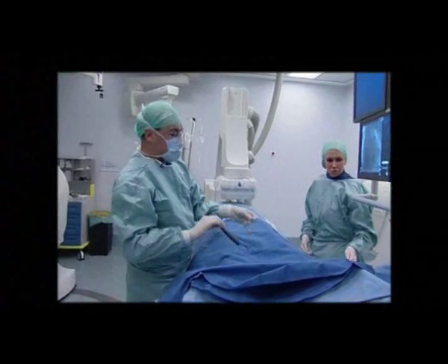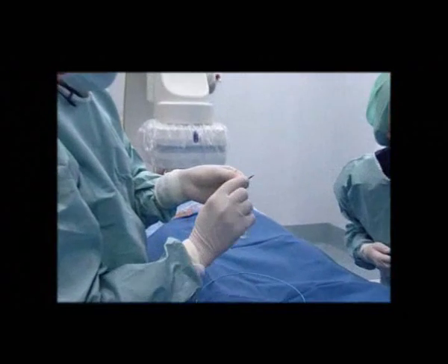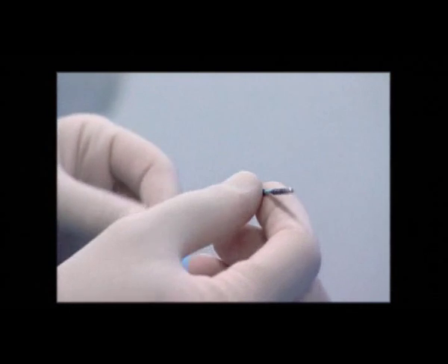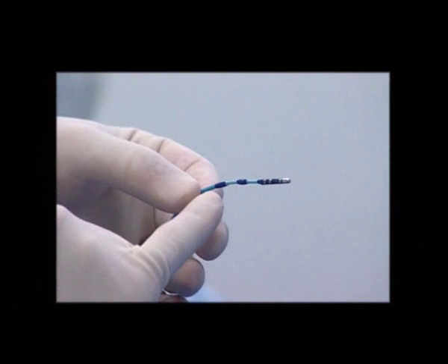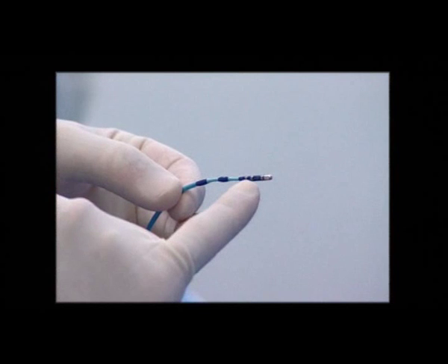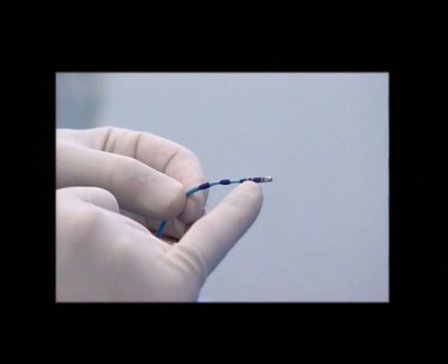This is the dedicated catheter. It's a 4 mm tip, non-irrigated catheter, and as you see, it's a very flexible catheter. It has three magnets inside for navigation — one here, one here, and one here. Being a Navistar catheter, there is also a magnetic sensor in the tip.